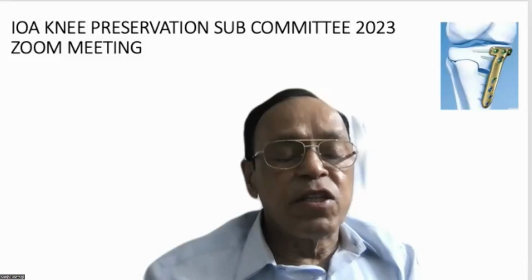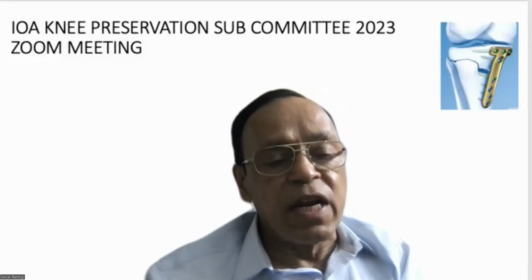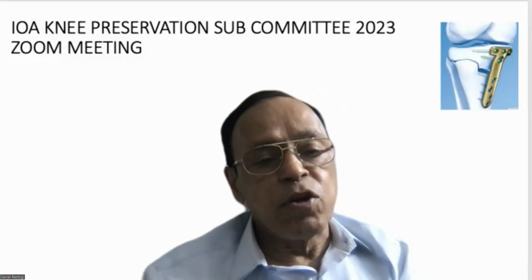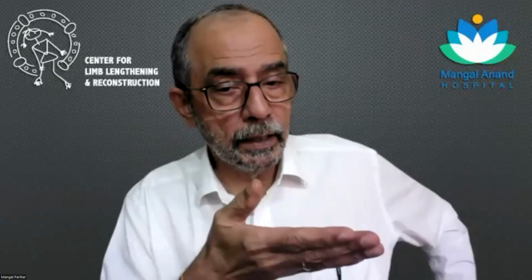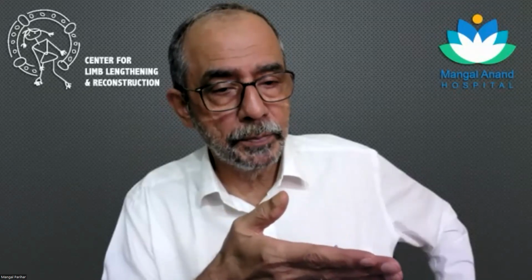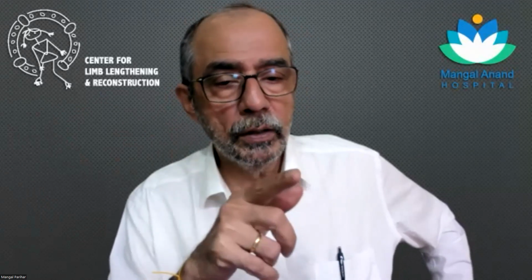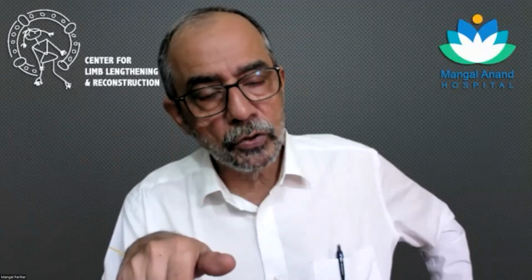When you do an open wedge, the patella is shifted distally and laterally. So does it make any difference on the patellofemoral joint? I showed you that paper by Gasbeek who talked about opening wedge creating an increase in patellofemoral contact pressures and moving the contact laterally. That is why they talk about your biplanar wedge going distal instead of proximal when you're doing large corrections.